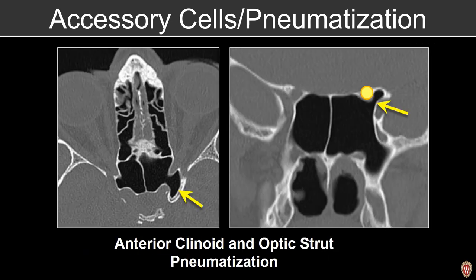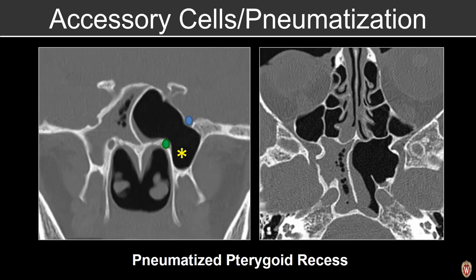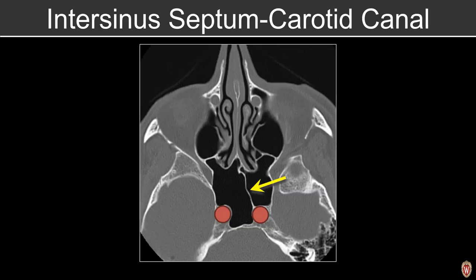We'll also comment on pneumatization of the clinoid process or the optic strut. Pneumatization of the pterygoid recess is important particularly when evaluating for a potential site of a CSF leak, meningocele, or encephalocele, as the bone covering a pneumatized pterygoid recess is often very thin and is a common site for a CSF leak. We'll also want to review the posterior attachment of the intersinus septum within the sphenoid sinus prior to transsphenoidal surgery — in this example the posterior attachment attaches to the carotid canal.